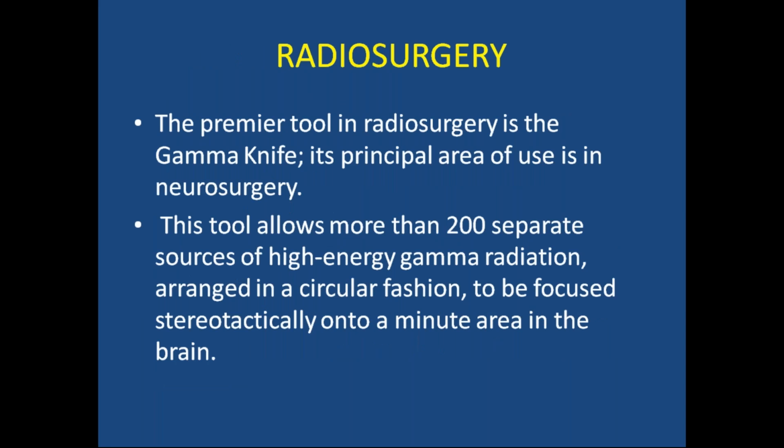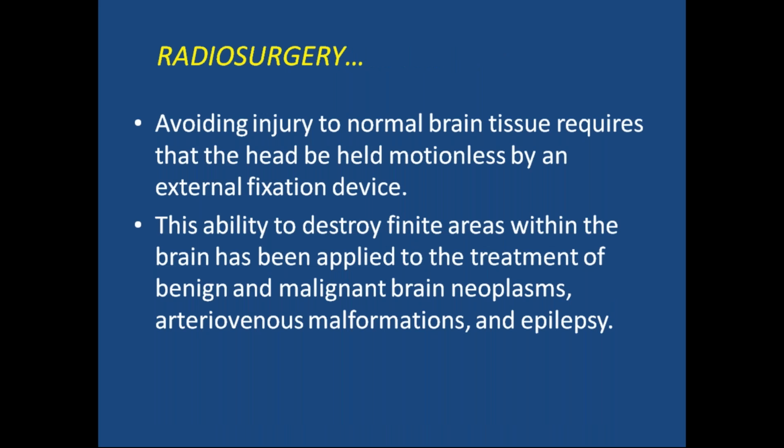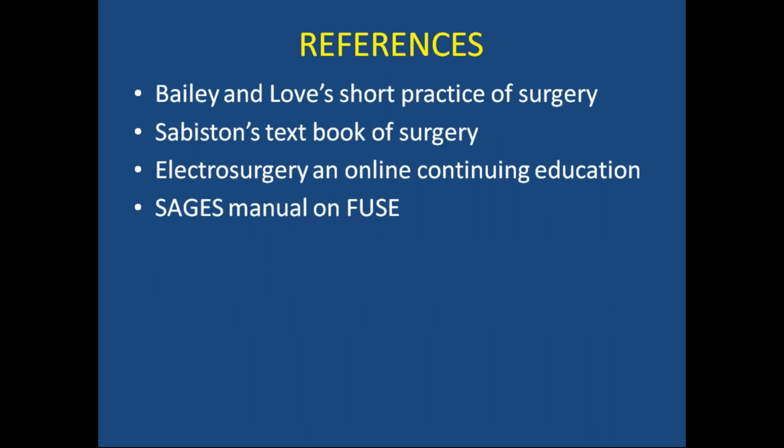So radiosurgery is another one, where the gamma knife principle is used in neurosurgery. You may not require this much of it. Okay. So thank you.